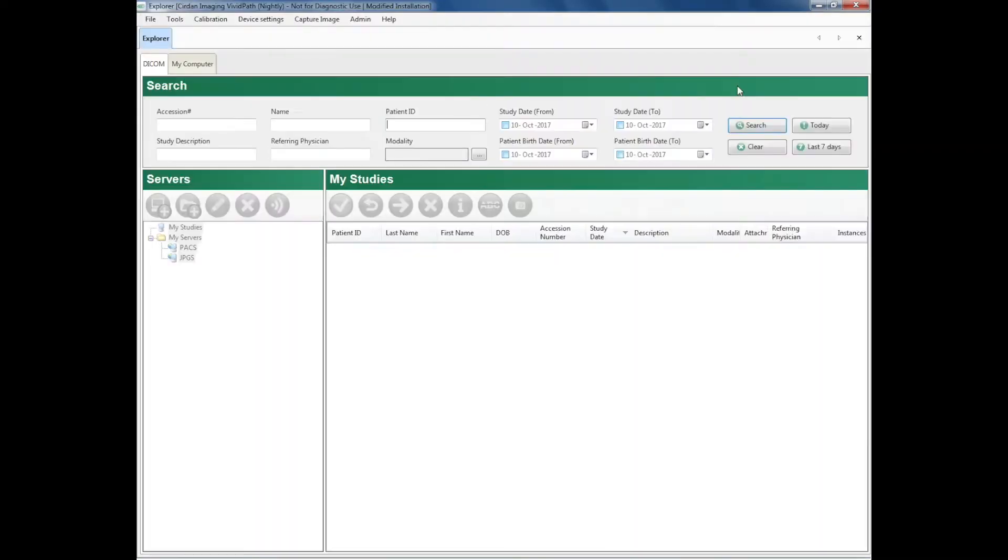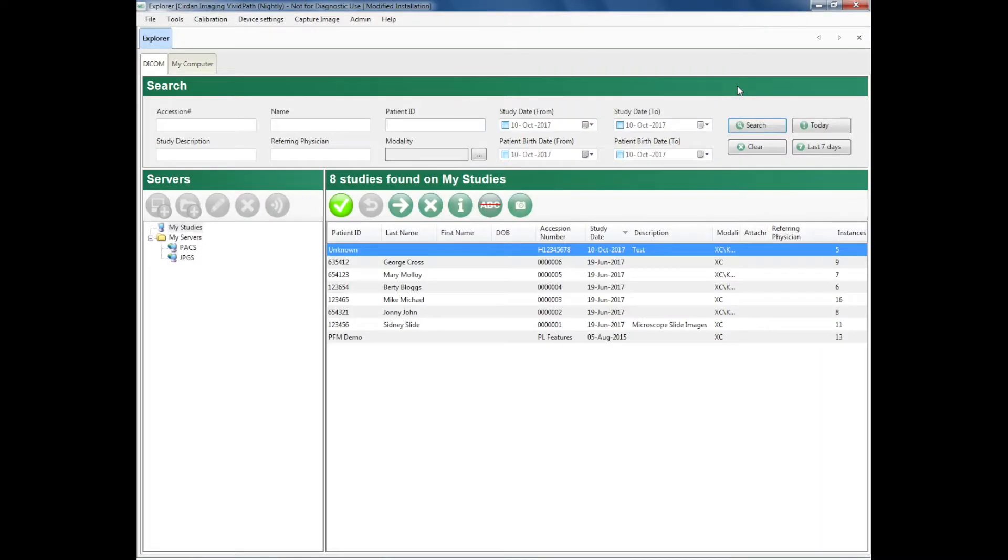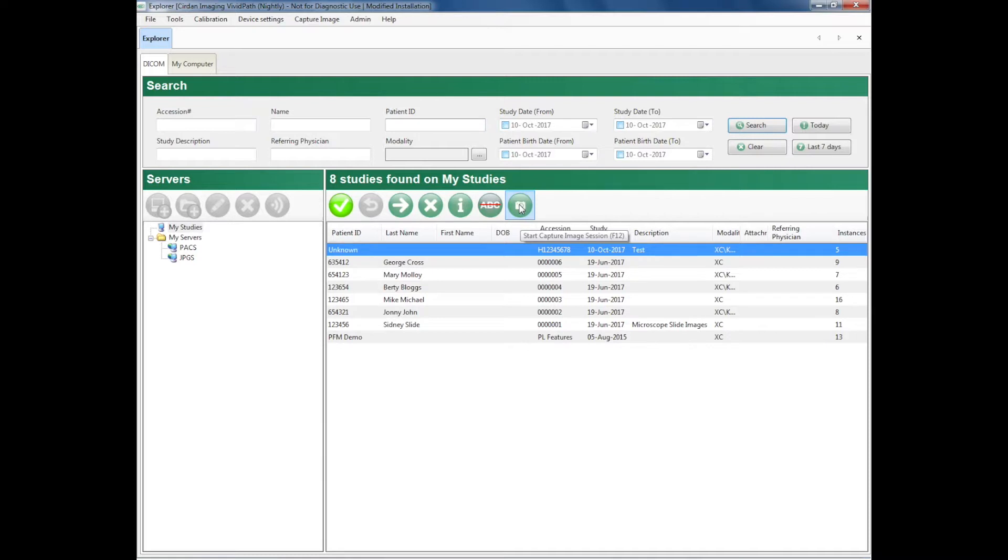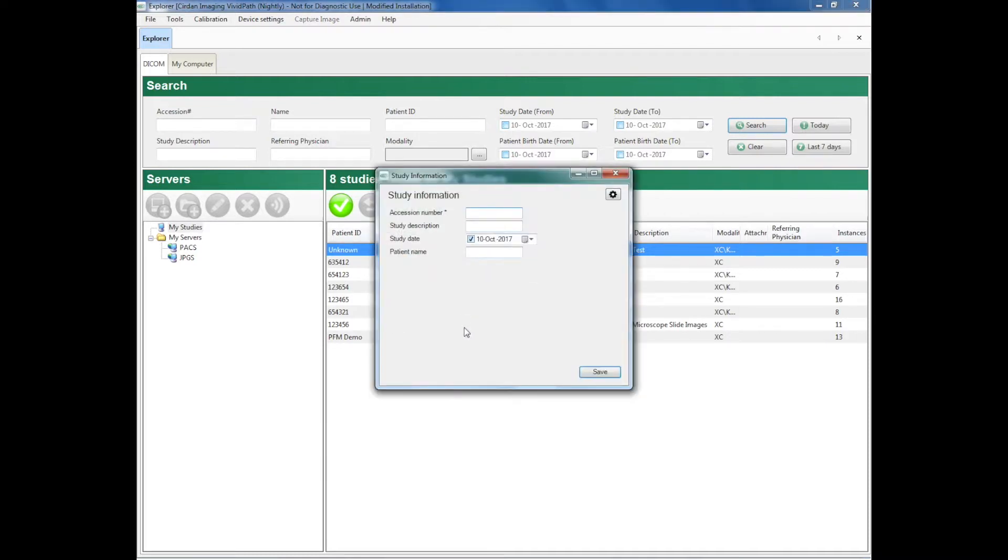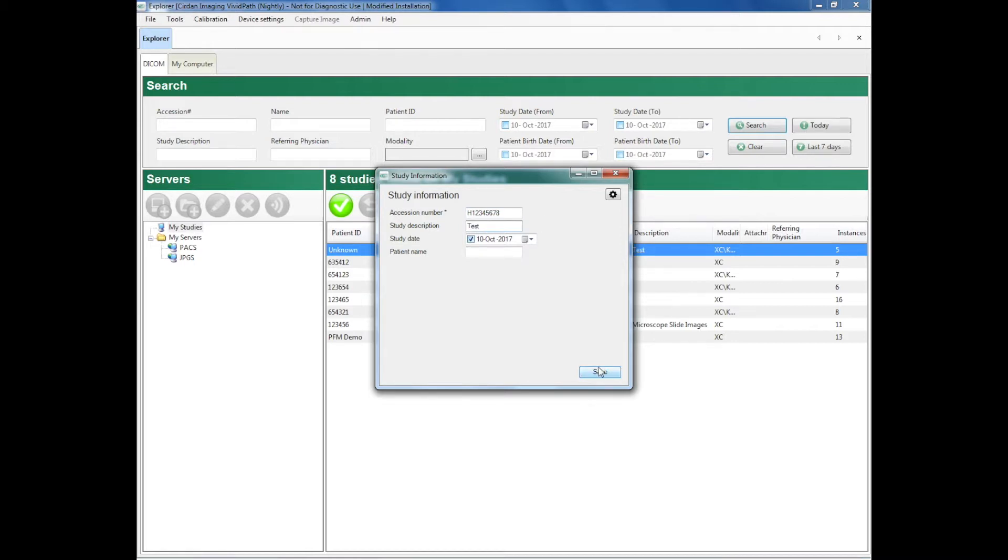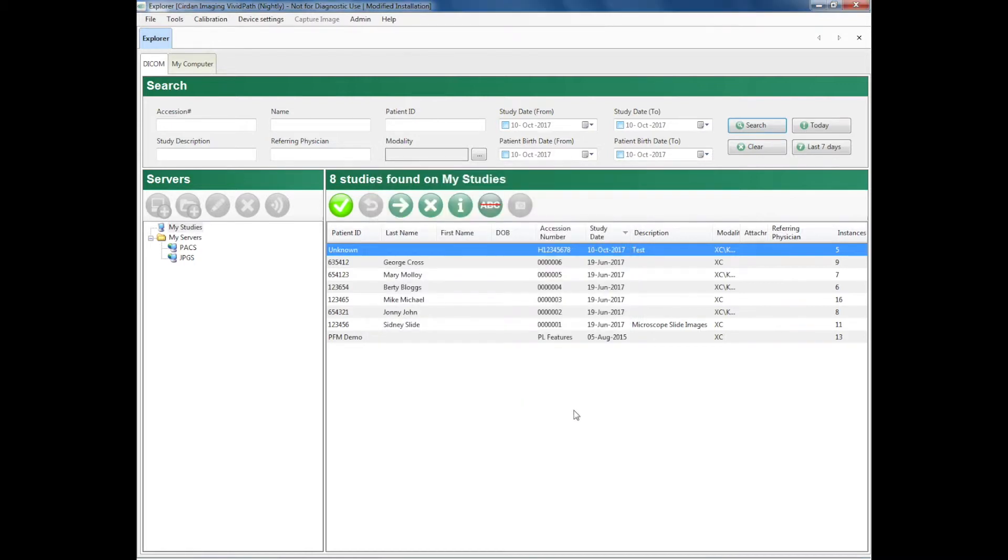The VividPath software comes up showing me cases which I previously saved and are on record. So starting a new case, I simply say capture session, it asks me for an accession number, I've entered that using a barcode, a description, test, and I'll save that.